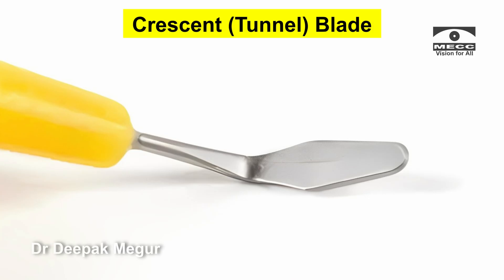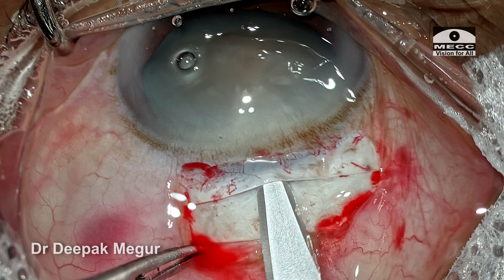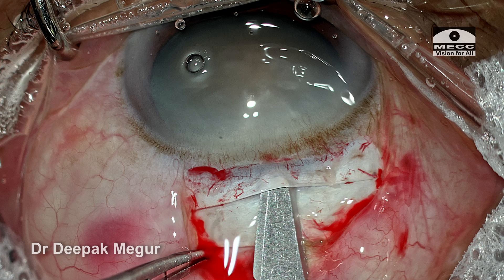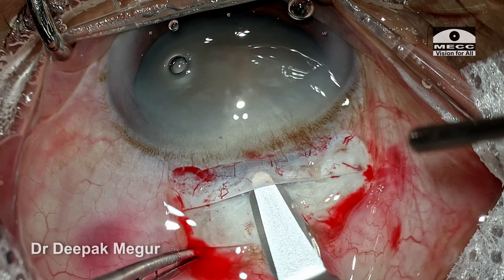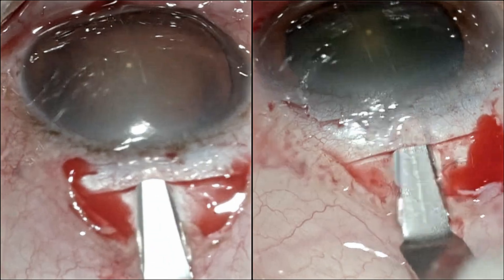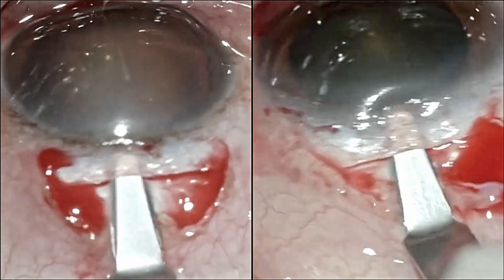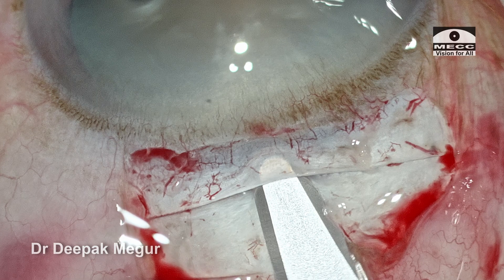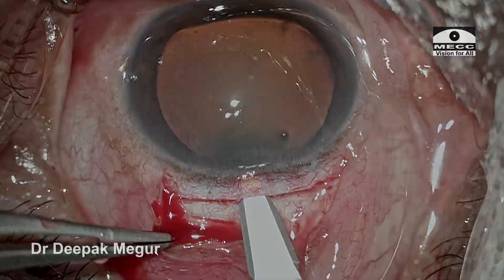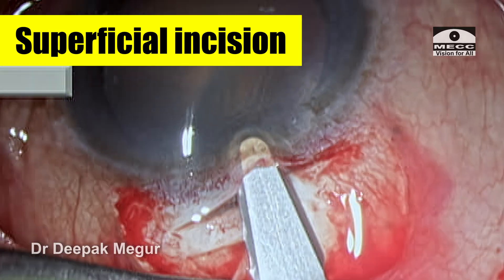Now it's time to create the tunnel. This is the crescent knife — this is how it looks. It is introduced in the center of the groove and the tunneling is begun by a wriggling motion. At this stage, as we begin tunneling, how are we supposed to judge the depth of the blade? We should not be too superficial or too deep, as both can have complications. The guideline is: the blade should be just visible under the sclera. If it is not seen or very difficult to see, assume it is too deep. If it is too clearly seen, it is too superficial.